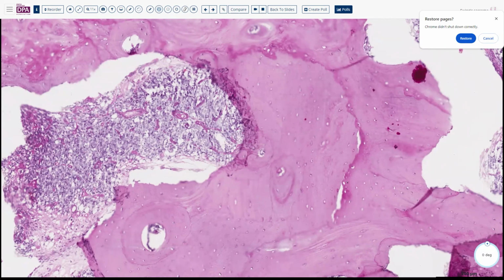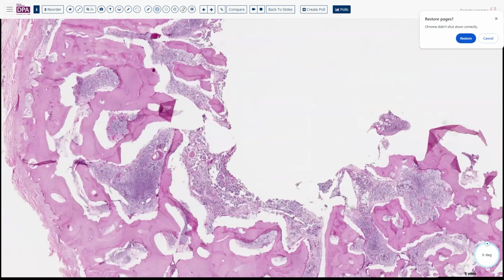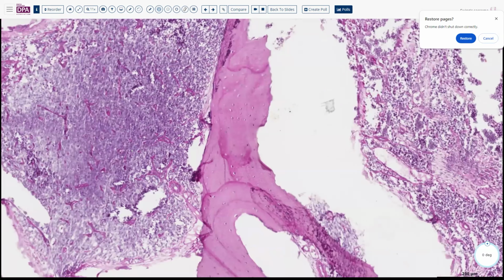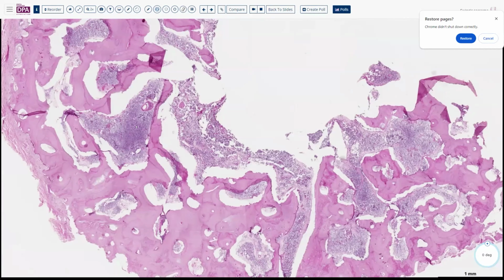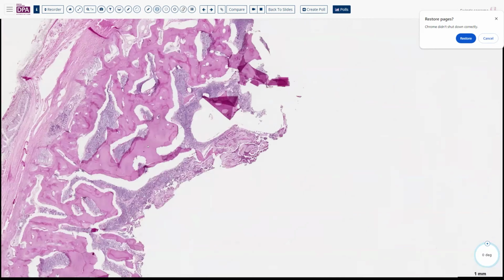Now, the reason we did a PAS stain in this situation is that in non-decalcified samples, Ewing's tumor tends to have a nice amount of glycogen, and so the glycogen will be highlighted. This obviously, however, is a decalcified specimen, and so all of that glycogen has been lysed or broken down, and even in these more thickly sectioned areas, you don't see too much evidence of that cytoplasmic content. The teaching point here, however, is to see the pattern of growth of this tumor.